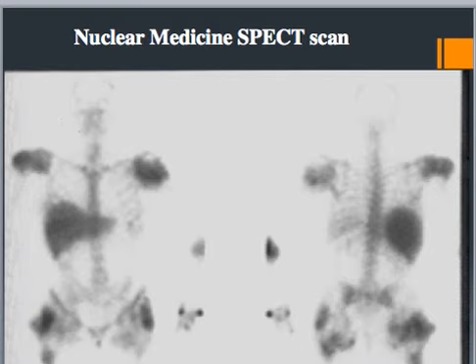As you can see, nuclear medicine images are very low resolution images. This scan shows the tracer uptake in the liver. You can see the liver here, right? All of those radiopharmaceuticals have accumulated there in the liver. That's one of the most common causes, metastatic disease, when you find the tracer uptake in the liver. When I talked about the hot spots and cold spots, I said the hot spots are white and cold spots are black, but this image is inverted, so it's going to depend. These hot spots are black on this image. You've got some spots up here in the shoulders, here in the liver, and then in the hips and pelvis.